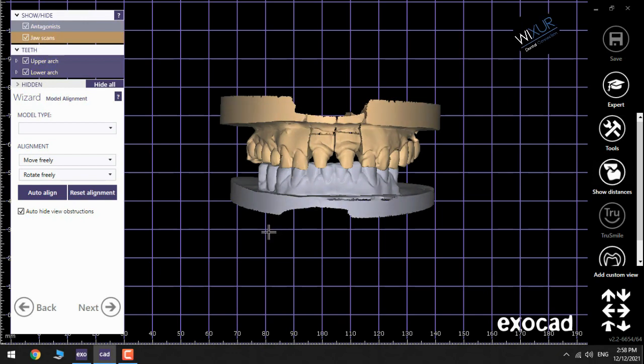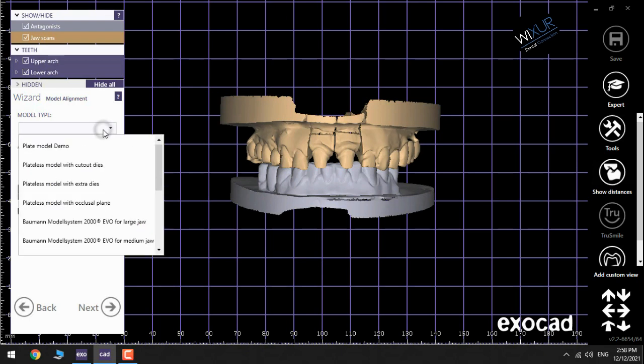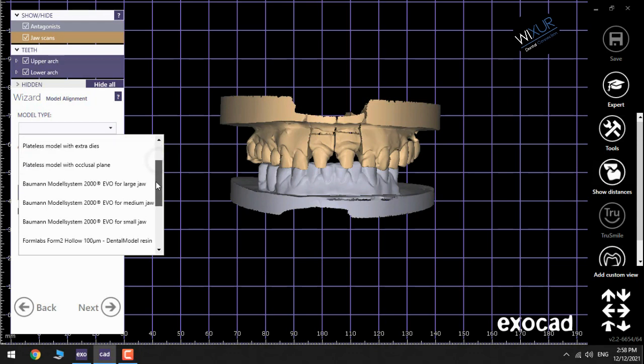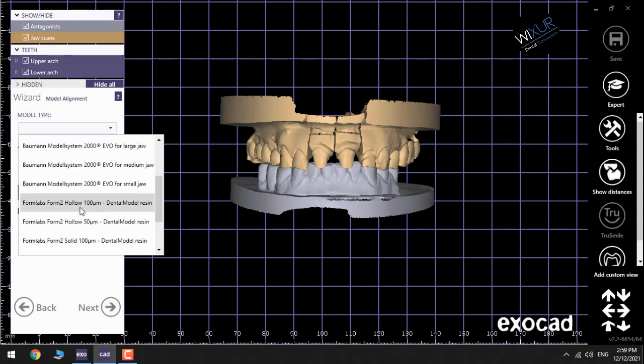After clicking on Model Creator, the first step is to choose the type of the model you need. What I usually choose is FormLabs Form 2 Hollow 100 micrometers because of the better results you need for the better results after printing.